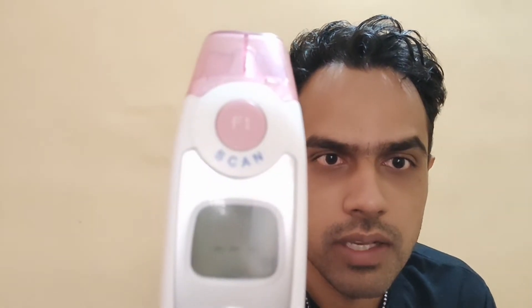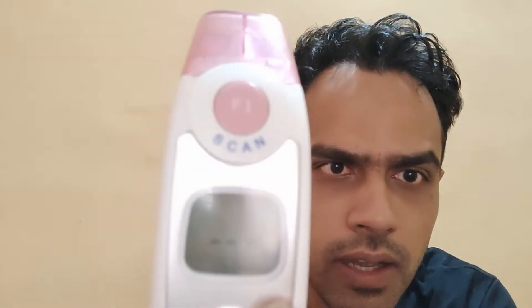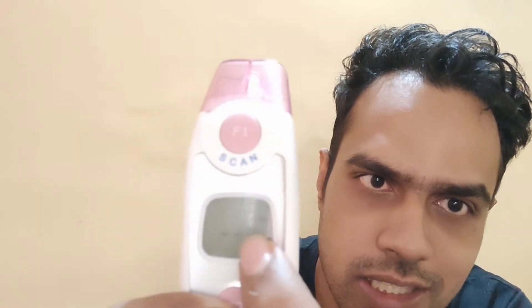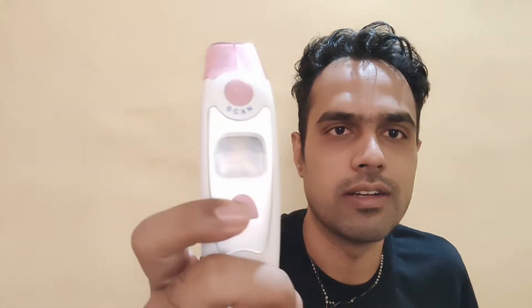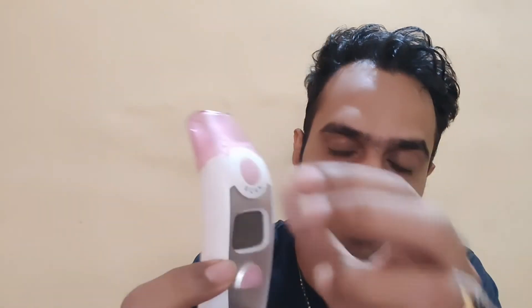Hold on to F2 and now you can see the M symbol appear, followed by the Fahrenheit symbol coming up. Once you see the Fahrenheit symbol, press F2 again and it changes to Celsius. Now the thermometer will check temperature in Celsius. Just turn it off once.